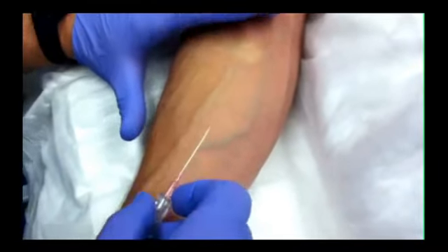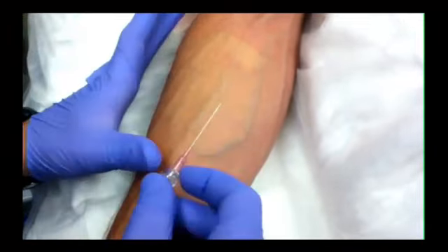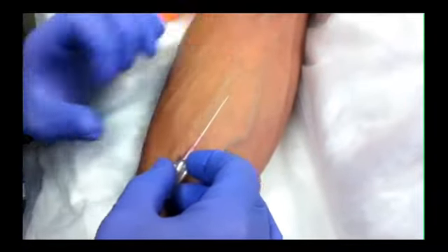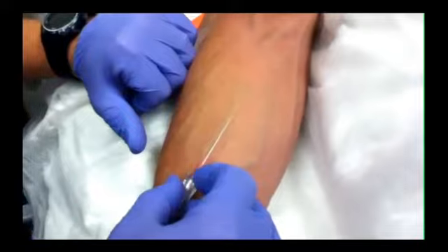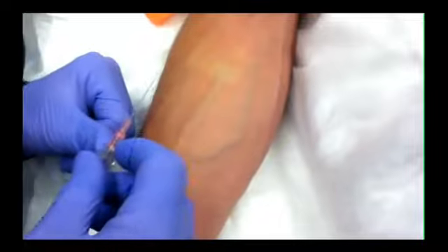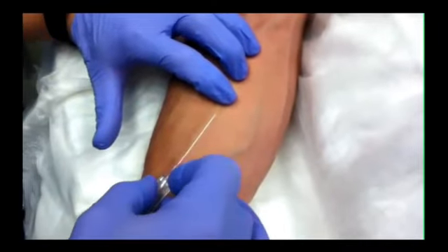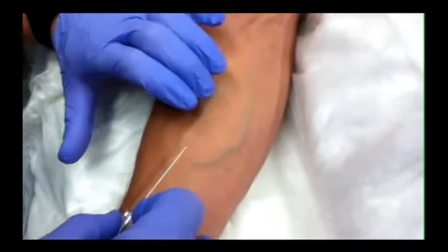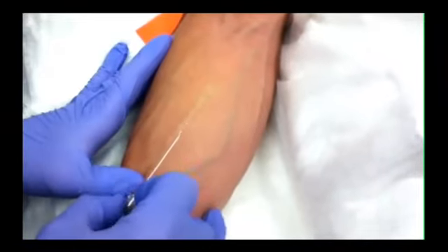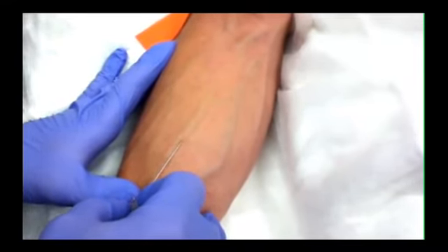I usually go a little bit on the side and then enter the vein. For these big, easy veins, I know there's enough room for the catheter, so my determining factor is making sure I have enough room for where the catheter is going to end up — I have to plan ahead. I'm going to poke down here in this straight section of the vein. If I can't feel the whole vein all the way up, I might need to back up and go where I can feel it. I usually just tell the patient I'll count to three — I prefer a quicker technique — poke on three: one, two, three.